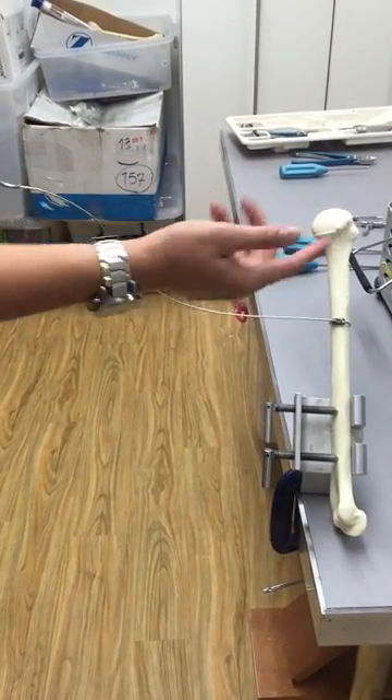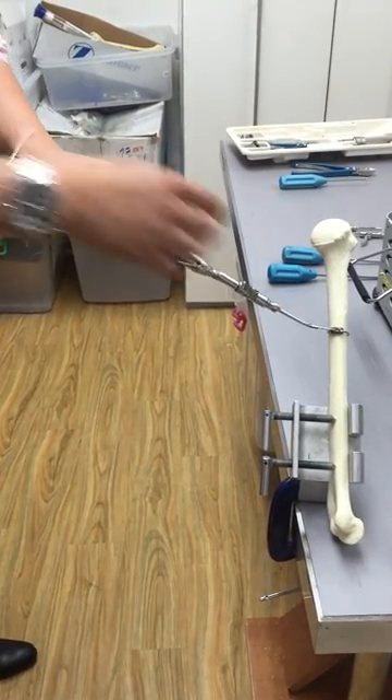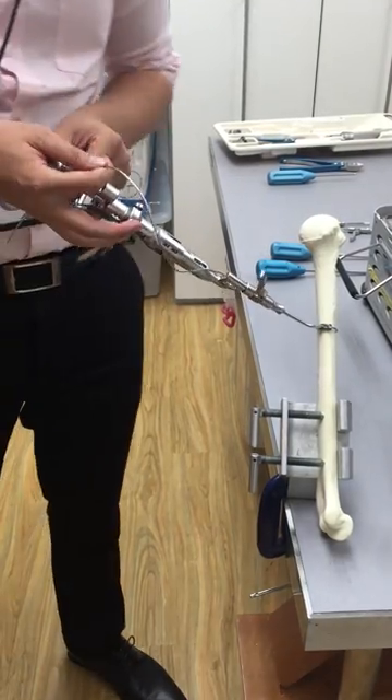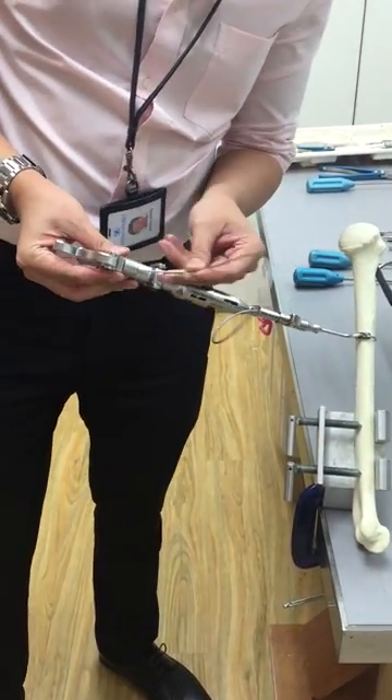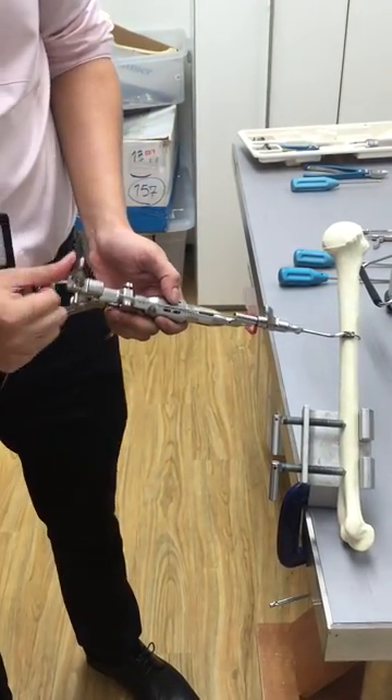Once you have your cable through the bone, put in the tensioner gun, slide it through the bottom hole and then through the hole at the top part. Once this is in, lock it.